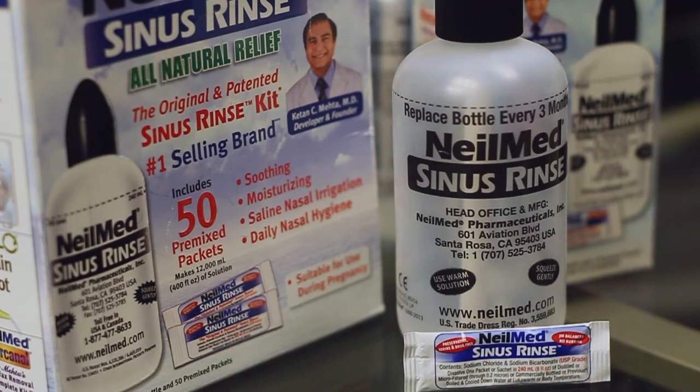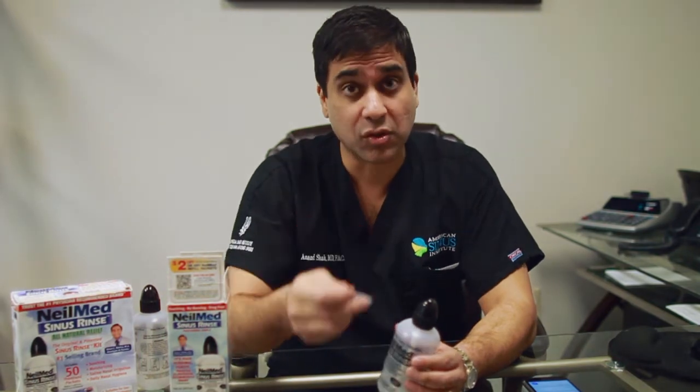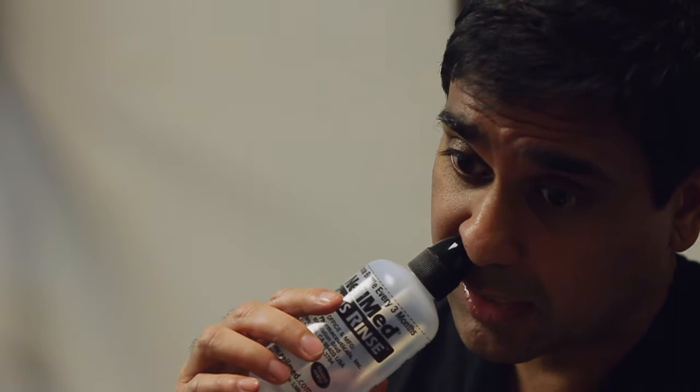This is one system that I like. You can see it comes with a bottle and it comes prepackaged with the mixture, and you add distilled water. What's important to consider is you put it on one side and you yourself will find your sort of sweet spot where you want to angle your head — a little bit of positive pressure, which is one benefit of this system.